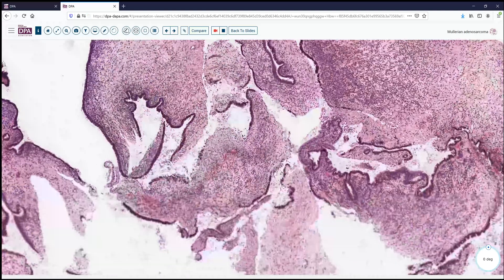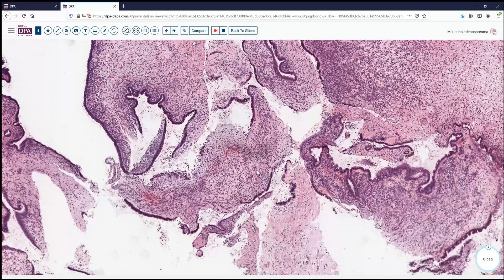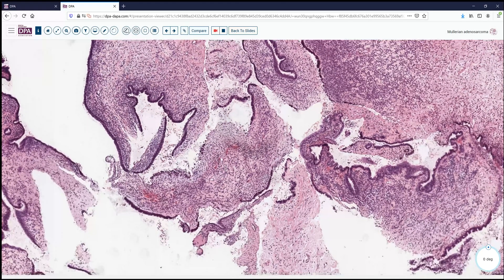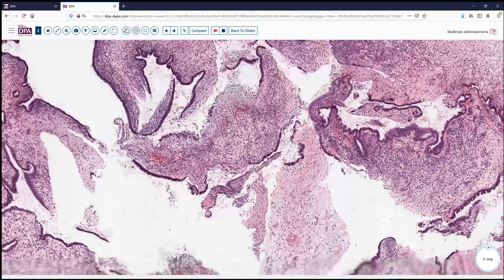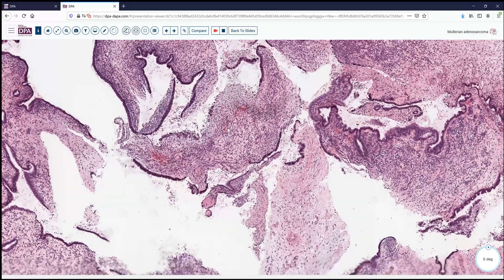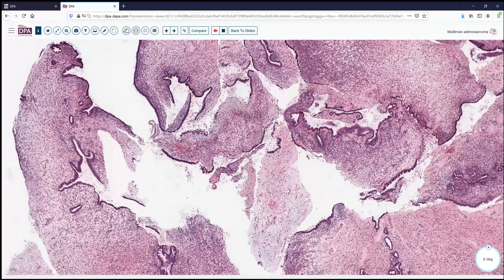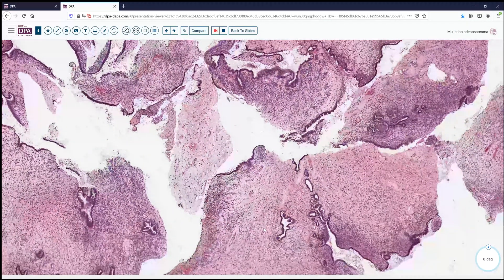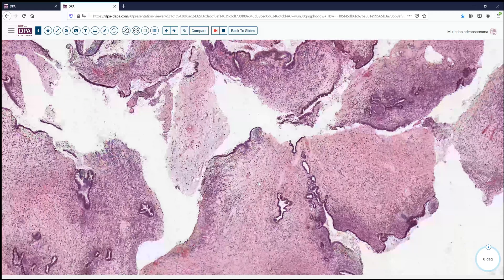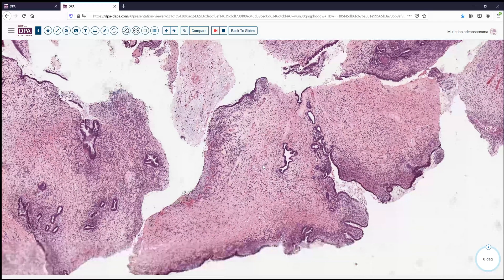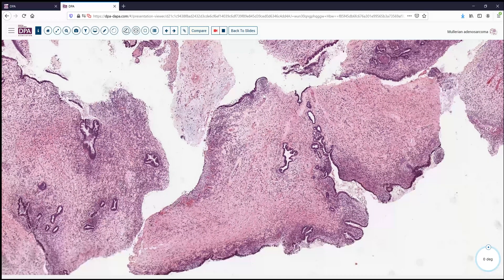As we look around, we can see that there's really no significant atypia to the epithelial component. But this is clearly a biphasic neoplasm. It has, as we can see at low magnification here, a somewhat more cellular zone immediately beneath the epithelium and surrounding these glands.